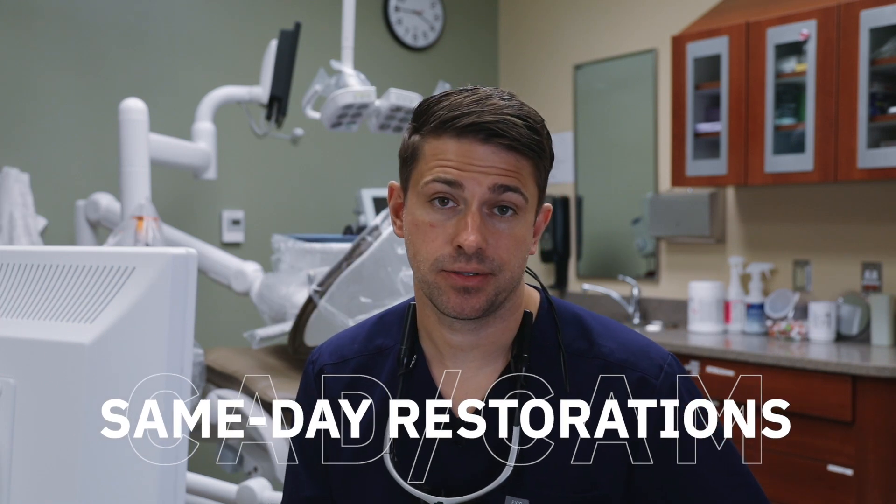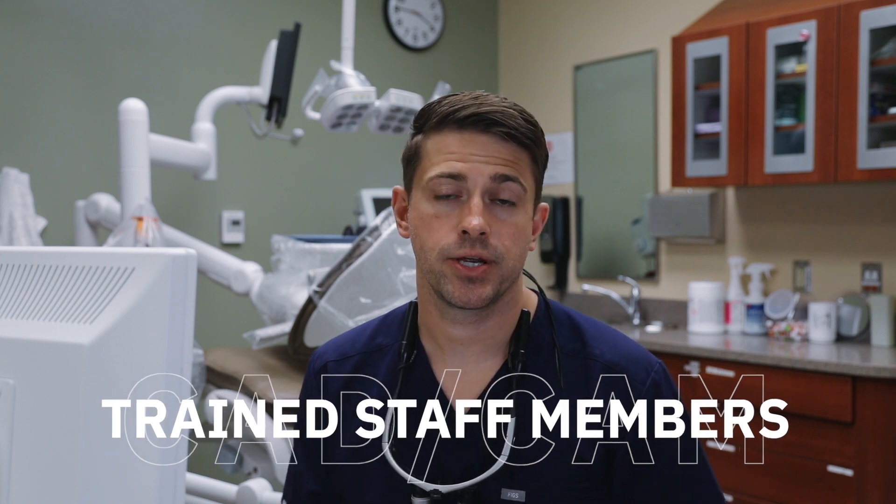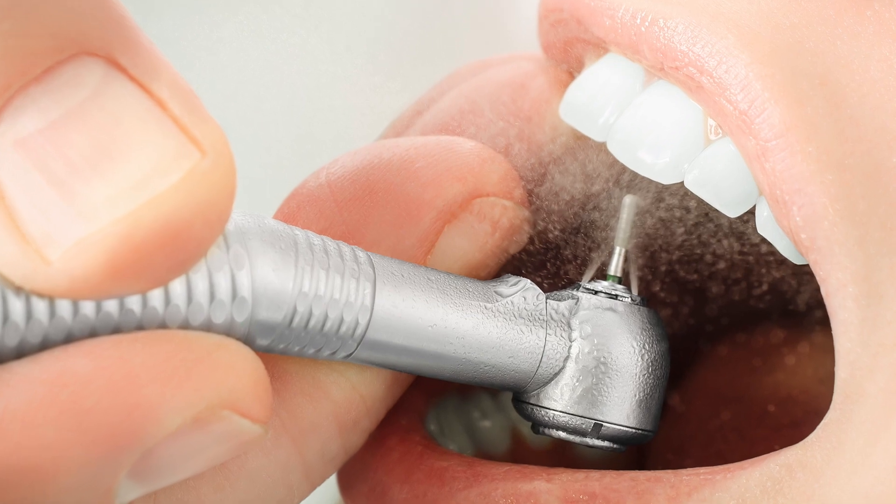CAD CAM can be faster, and there is also the ability to fabricate same-day restorations. This eliminates the need for temporary restorations, and local anesthesia is not required as often. These savings in time and labor have the potential to reduce overhead and offer patient satisfaction in a single visit. Over time, your dental team can be trained to design and mill restorations. To maximize efficiency in the dental clinic, dental providers should focus on the things that only they are trained to do. You can prepare the teeth and then a trained staff member can do the rest with your supervision. The time you save by having a trained staff member can be invaluable and further add to the financial viability of the CAD CAM technology.